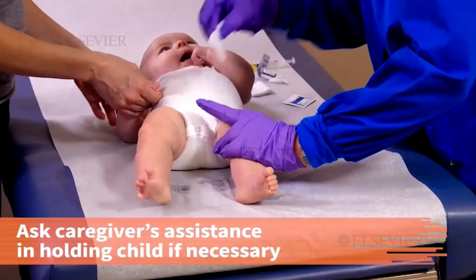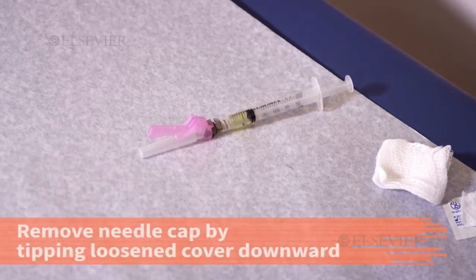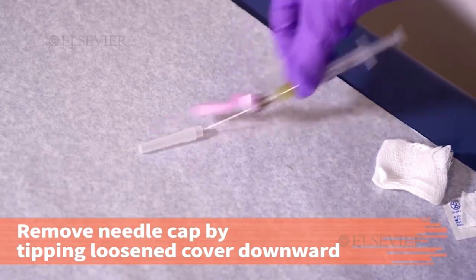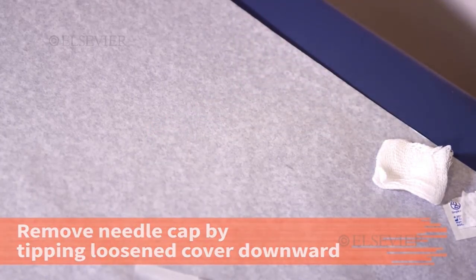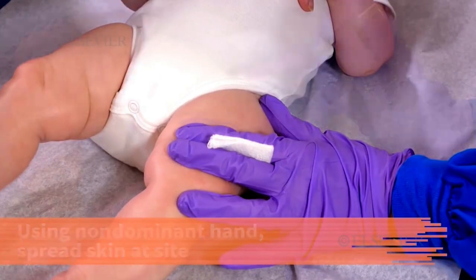Ask for the caregiver's assistance in holding the child still if necessary. Remove the cap from the needle by tipping the loosened cover downward while maintaining the sterility of the needle unit. With the thumb and first two fingers of the non-dominant hand, spread the skin at the site tightly.